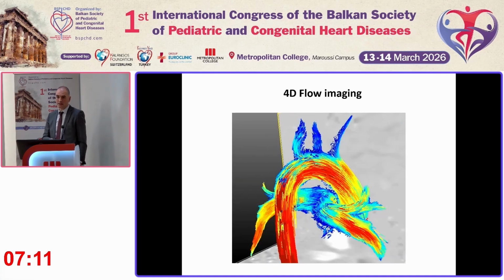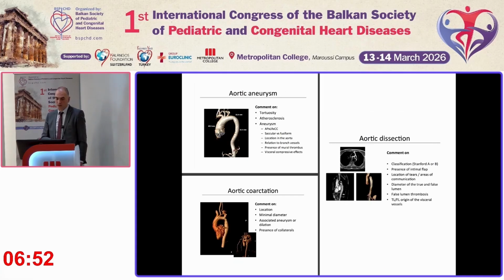And get images like this one with information that exceeds just the volumetrics or the velocity, but also provides information on shear stress, on other parameters that might inform from a prognostic point of view in the near future as well. These are the images that I may acquire with the MRI.